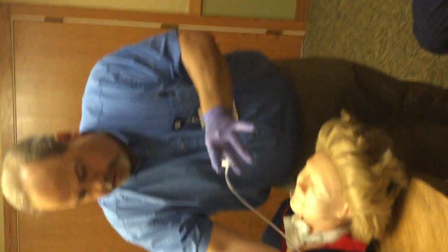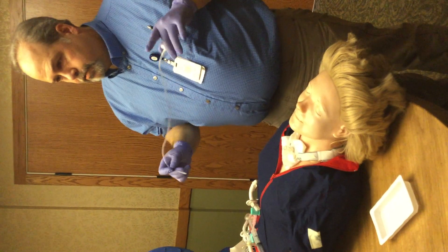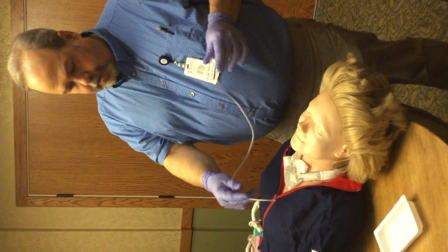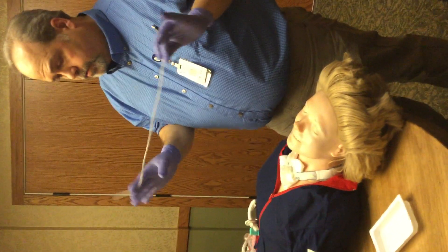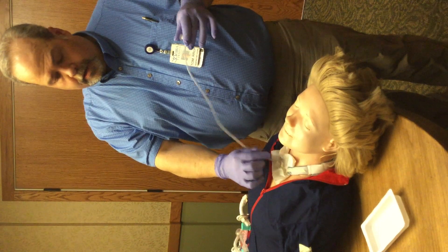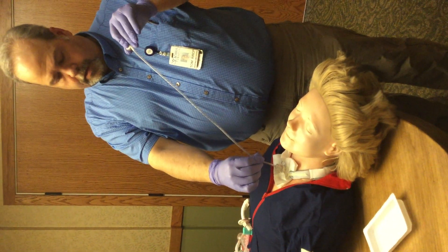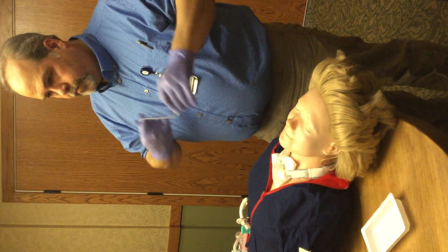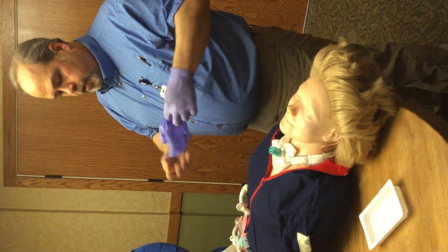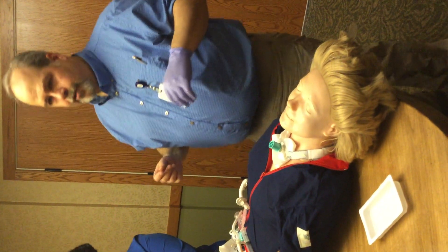In between passes, you can suction up a little saline. Even before you start, you can suction up a little bit to confirm it's working — there's nothing more frustrating than going down and finding the suction isn't on. Textbook is about 10 seconds. Back off with intermittent suction until you get to your tip. Once you're not getting much, you can wrap it, put the speaking valve back on, and take your gloves off over the top so when you throw them in the trash, nobody catches a contaminated glove on their scrubs.